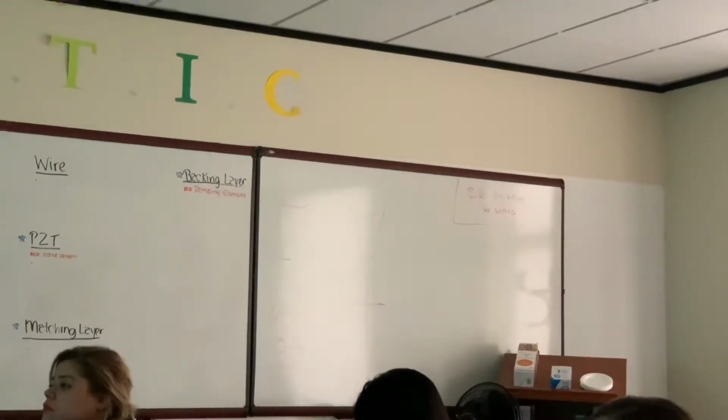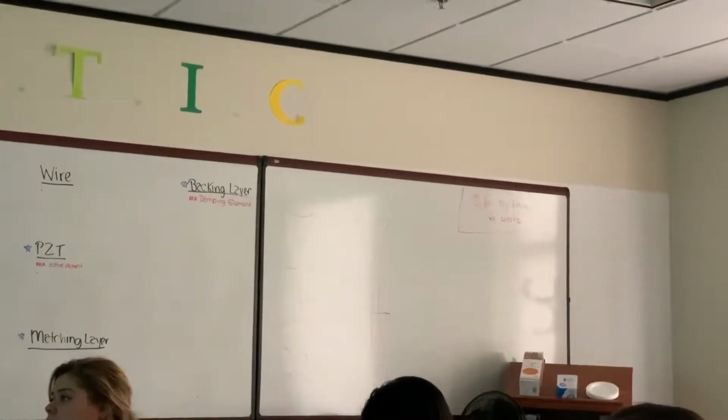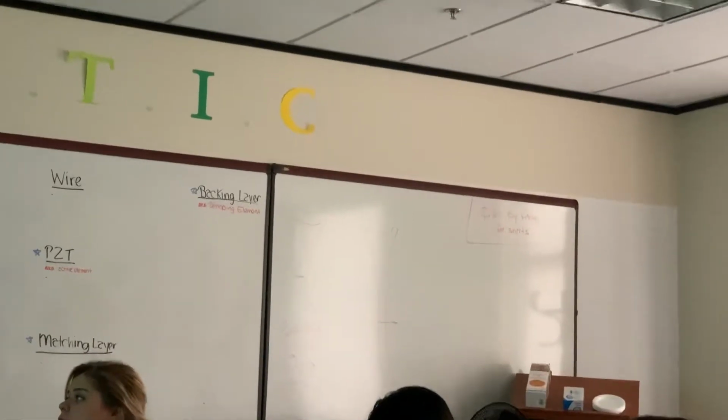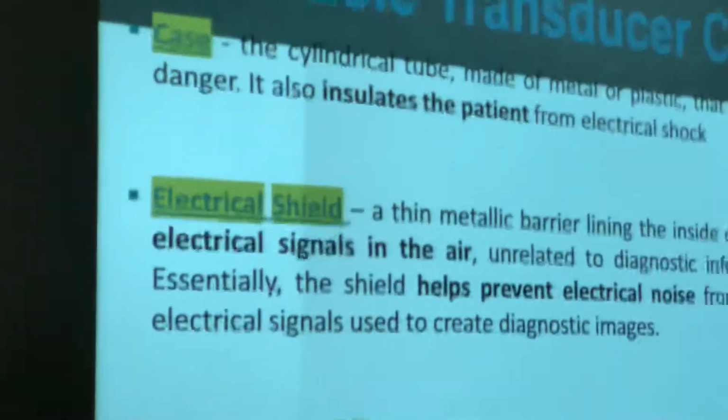Okay? That's why it's important to move your focus where it needs to be, because we want all our images to be above the focus, so we can get the best resolution, axial and lateral. Okay?